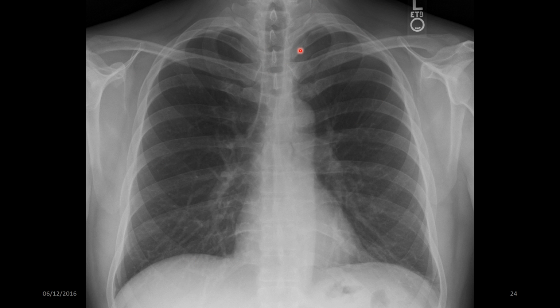You can see an awful lot of information on a chest X-ray, and that's why we tend to do them quite often, because you can get an immediate answer. Does somebody have a chest infection? Does somebody have a pneumothorax? Does somebody have X, Y, and Z? And they're very, very useful in those terms. So we're going to leave that there, and we're going to move on to mobile radiography next.